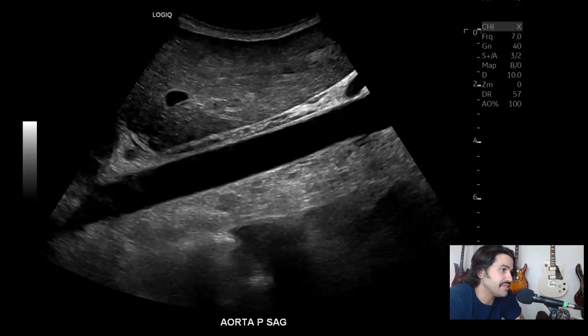So beginning sagittal, proximal. You got your liver — this is your aorta in sagittal. Look at how crisp that looks. Now I'm using the C26 probe. That's the one that's a smaller curve probe, like the regular curve probe but smaller.